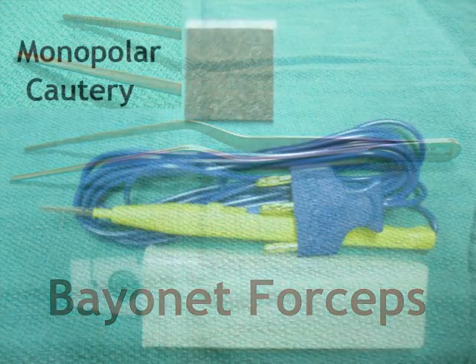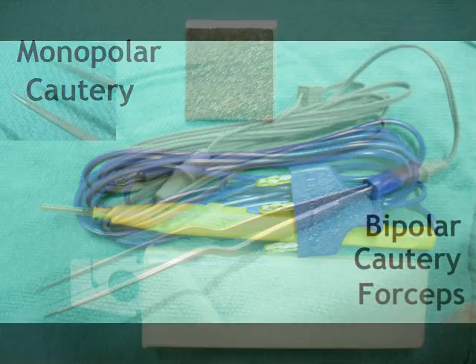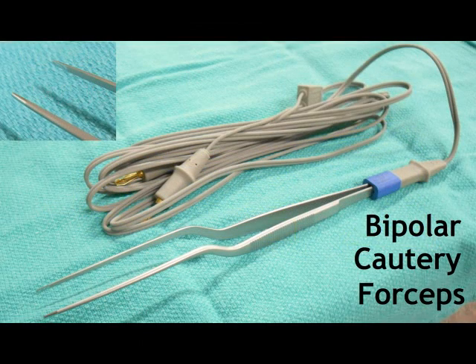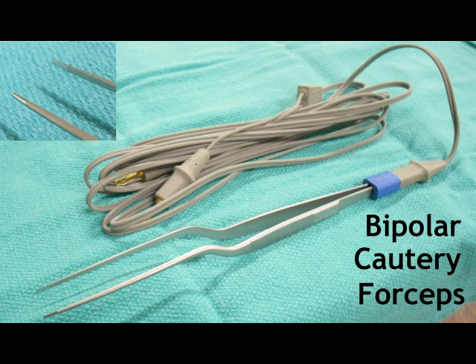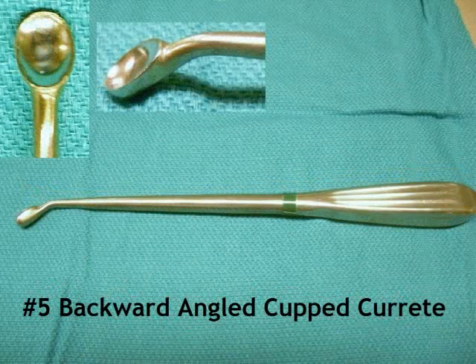The cauteries come as monopolar and bipolar. The bipolar coagulates between the blades. Laurie, show us what you have for curettes. They come in different sizes. The most commonly used sizes are the number three cup curette and the number five cup curette.